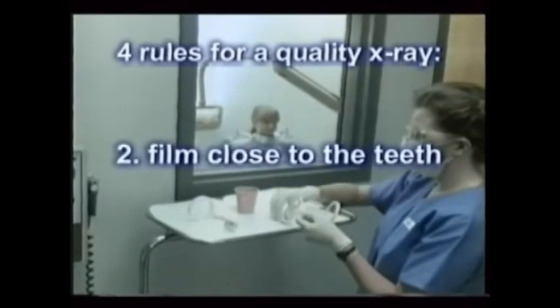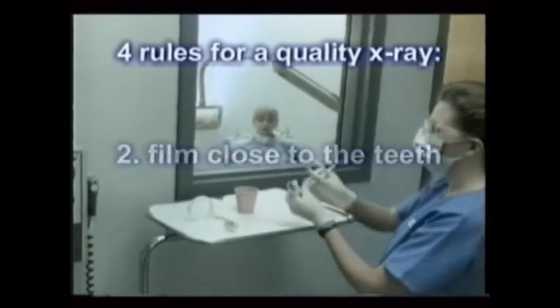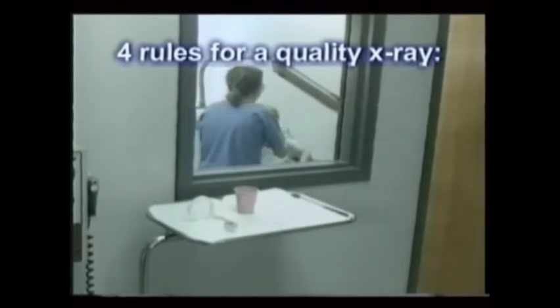Second, the film should be as close to the teeth as you can get it. This minimizes magnification and blurring. When you forget, simply use your hand to project a shadow and move it in and out from the surface as a reminder.